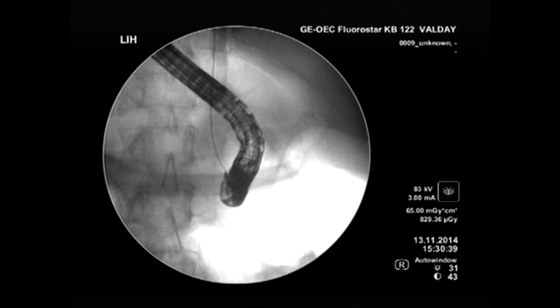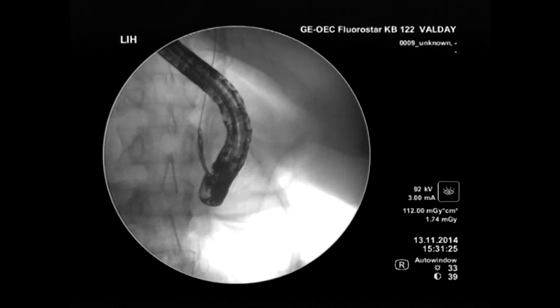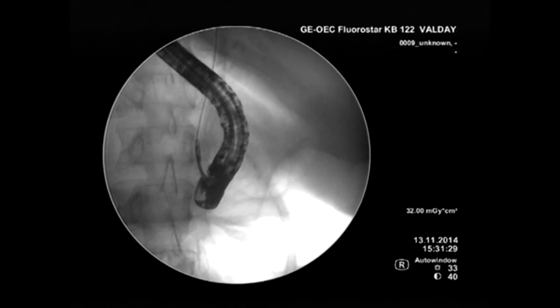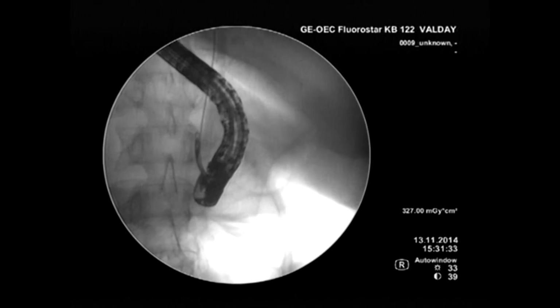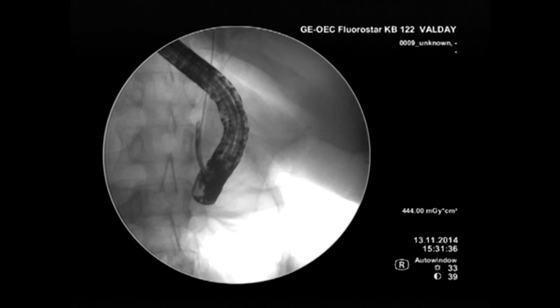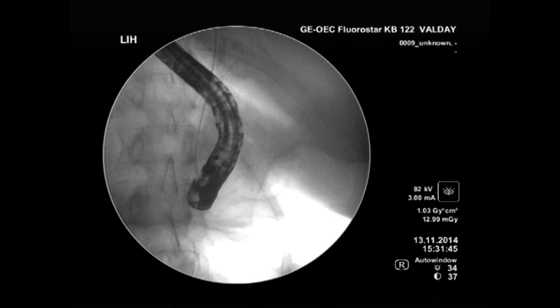So I try to direct the forceps in here. So now it's somewhere inside. This is the correct duct. This is why I leave the wire in, because now I'm pretty sure that I'm in the common bile duct. Please open the forceps. Open, open. It's open, good. So I try to put it into the wall. Now close. And take out. Let's see.